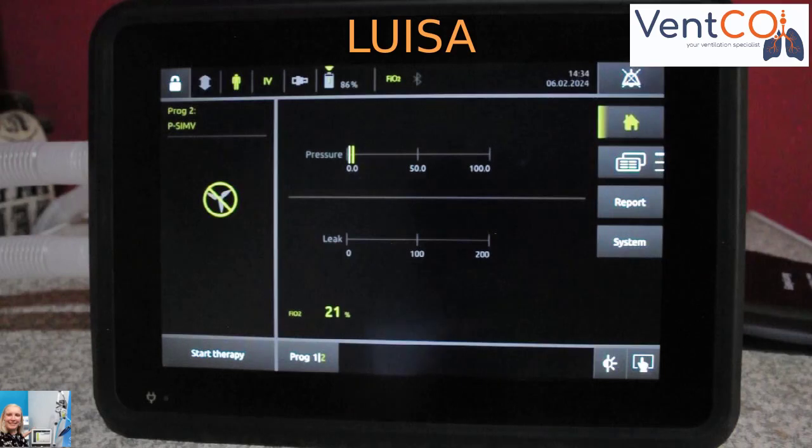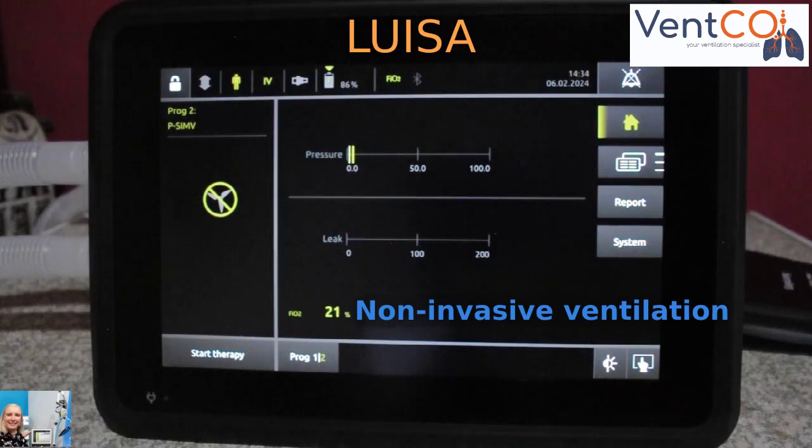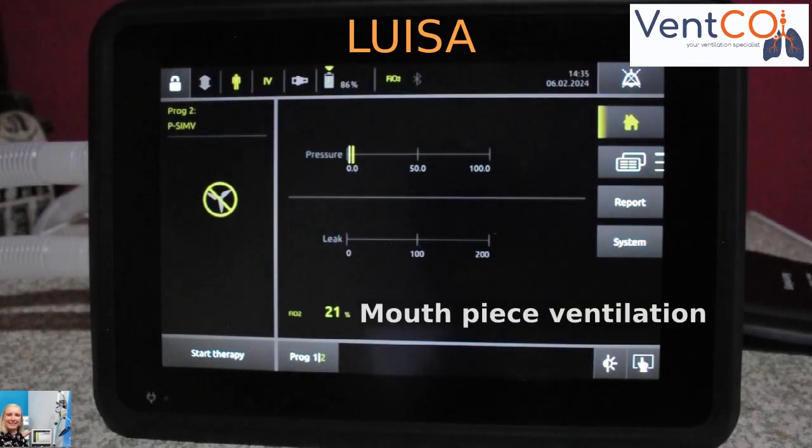The Luisa is an especially compact, lightweight and mobile ventilator, providing the full range of therapeutic options: invasive ventilation, non-invasive ventilation, high flow oxygen therapy, as well as mouthpiece ventilation.